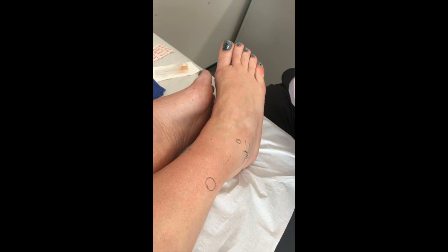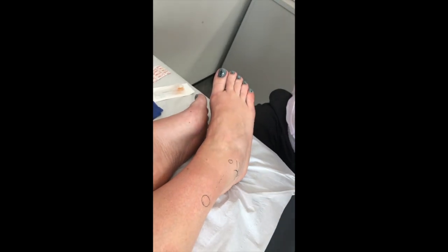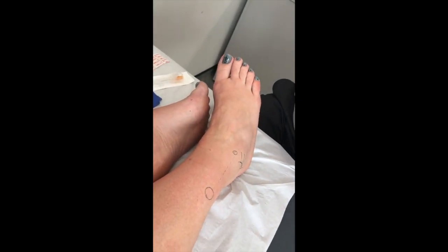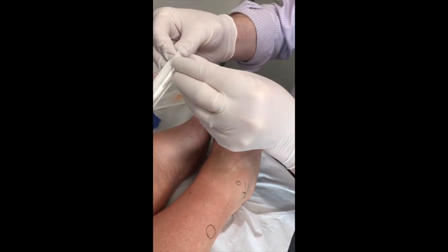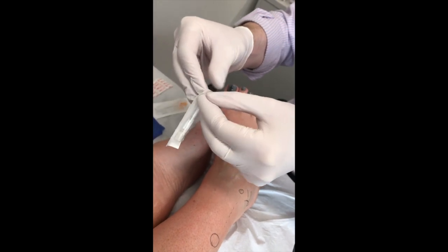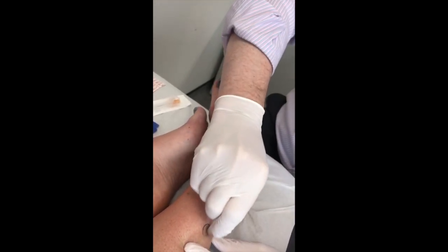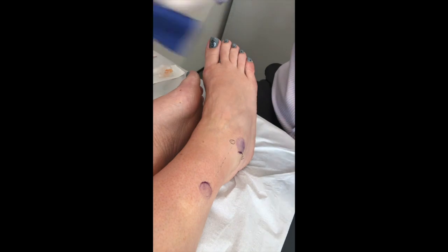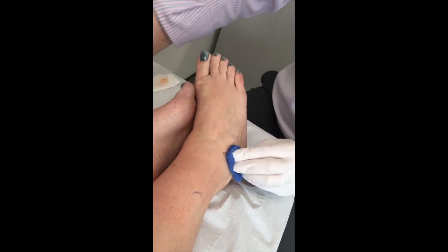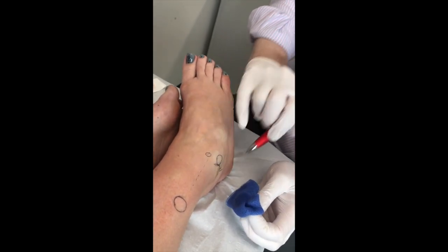So a bit of gloves on. Gloves come in two sizes: too big and too small. Don't laugh while you're holding the camera — keep it steady. Bit of skin prep; we have to do it under sterile technique. So we like these little chloropreps — these are really cool. They're plastic; they just break. And then we get a little bit of skin prep just there, coming in on the ankle. And that gives us two nice big grey mounds — get some of that ink out, and we'll just re-mark up so we don't miss the right spot.